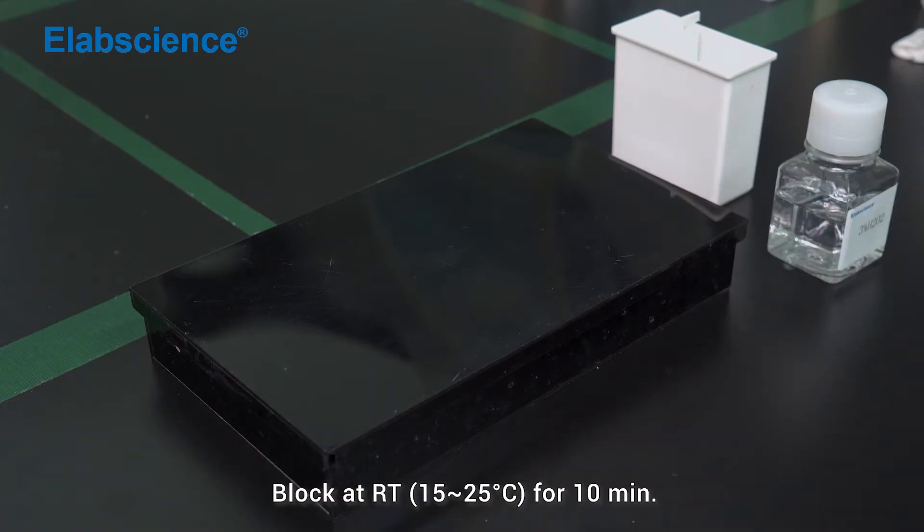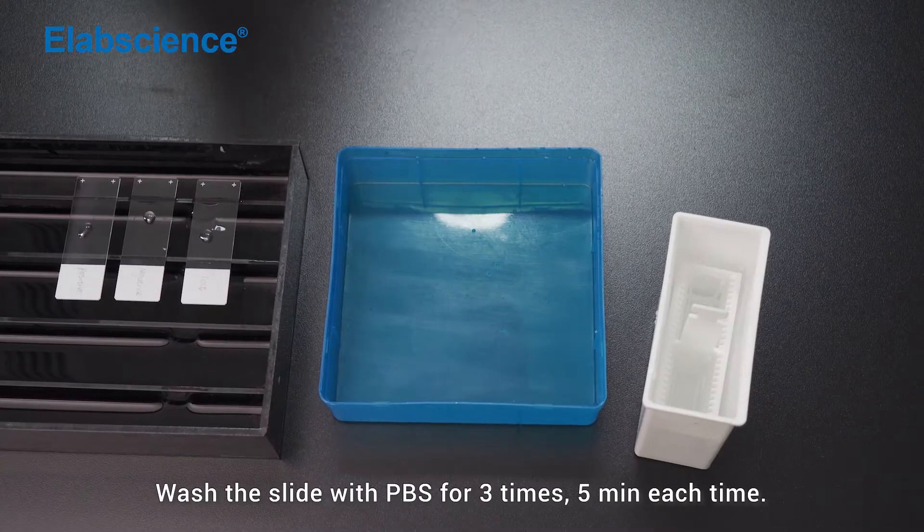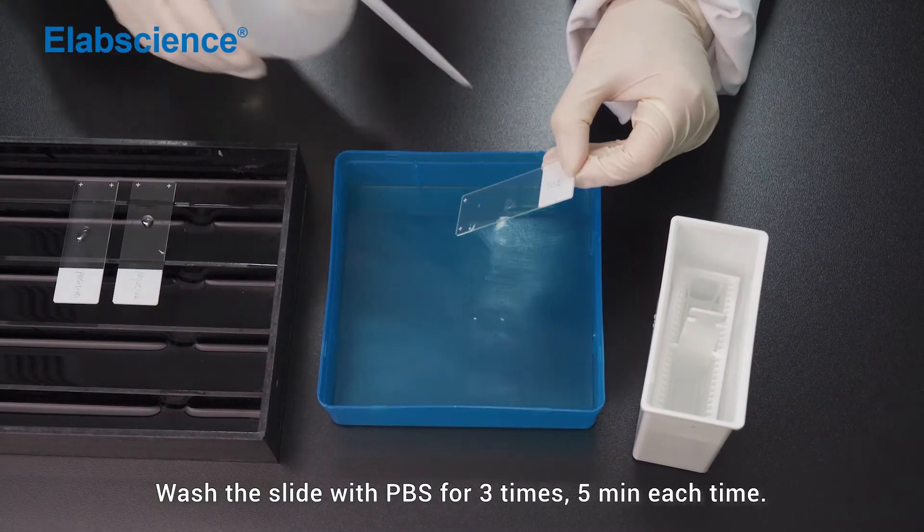Block at room temperature for 10 minutes. Wash the slide with PBS for 3 times, 5 minutes each time.